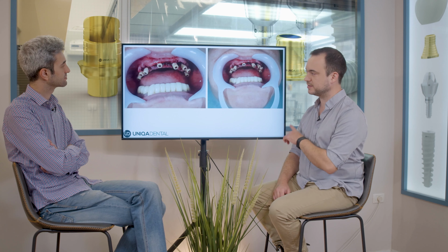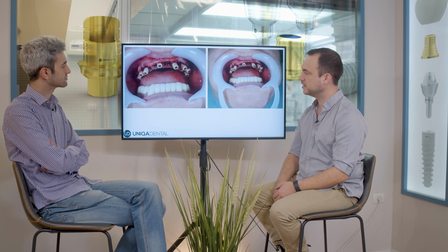You can see that we extracted all the teeth. We placed implants. You can see that all in all we have 8 implants for a bridge from second molar to second molar. It's on multi-unit level also? Yeah, the implants are quite parallel. We don't think that will be a problem.